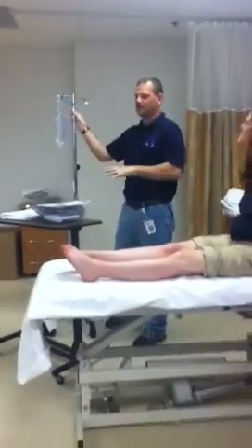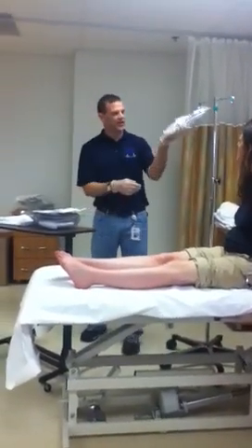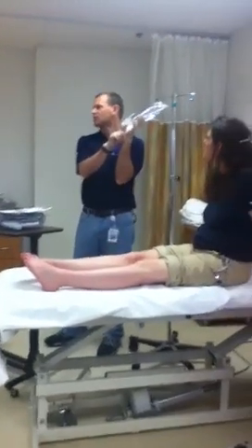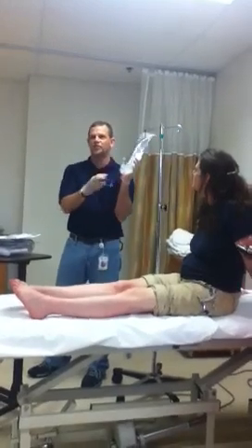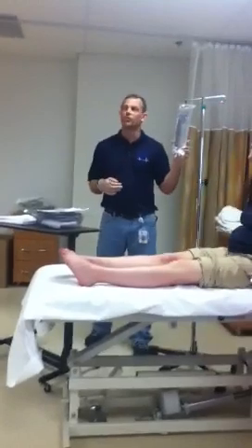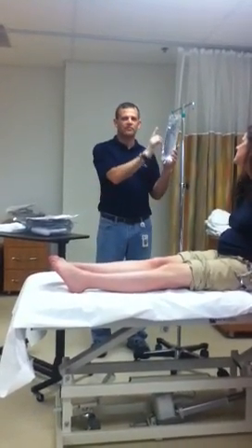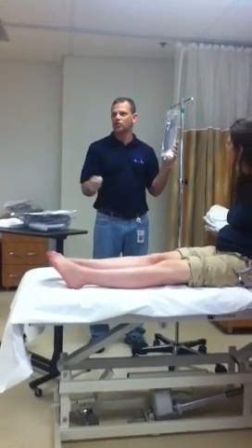I have my fluids here, and I've got two ports on the bottom of it. This little brown one is so a nurse can inject medication into it — just like they draw medication out of those things and they don't leak. The book talks about how you could actually inject an antibacterial or something into this to shoot it into your wound.